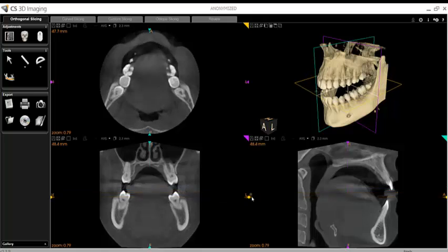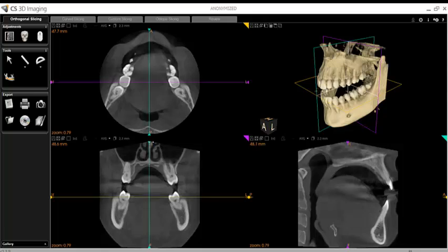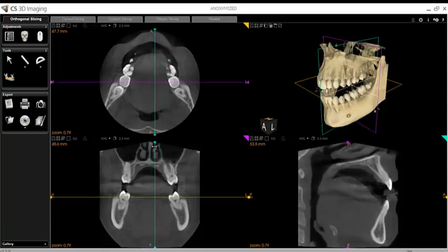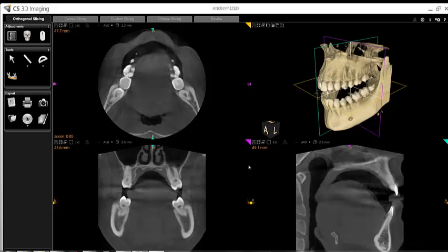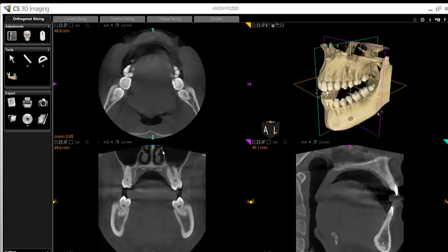The same holds true for the Coronal View and the Sagittal View. This is a good method for making large movements, but if I want to make smaller, more incremental movements slice by slice, I simply move my mouse to the view that I want to scroll through, hover my mouse over the image, and begin scrolling with the scroll wheel on my mouse. This allows me to move slice by slice in any direction.